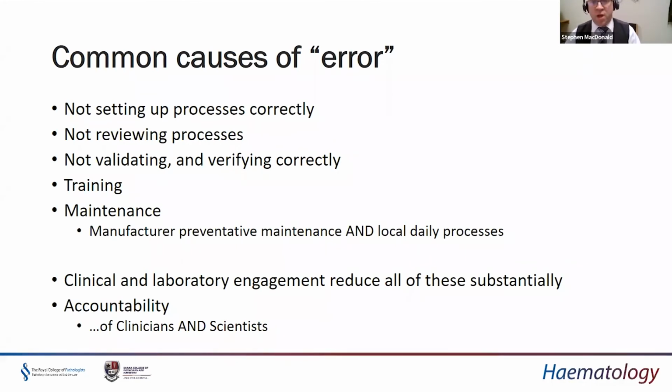So keeping on top of training, somebody can't be trained once then left to their own devices. There need to be spot checks, there needs to be regular assessments of that to make sure that when they were competent 10 years ago, they have maintained that competence, because people's roles change within a service as well. And things that they were doing 10 years ago are not the same things that they're doing nowadays.